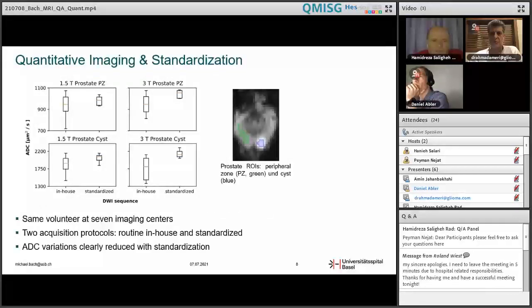I have now presented some phantoms and how these phantoms make it possible to check whether the MRI provides the correct quantitative values. In the remaining minutes, I would now like to discuss the fact that the correct quantitative values are not at all as unambiguous as one could assume, or more precisely, that the measured values depend on the exact parameters of the measurement itself.